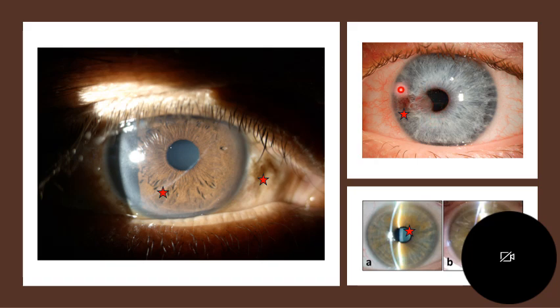In this picture, there is a vascularized mass on the iris, likely to be a tumor, and it has to be assessed. Here, the slit beam is able to illuminate a lens that has started to become cloudy. That is a cataract.